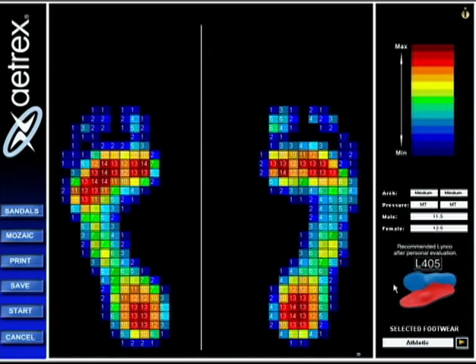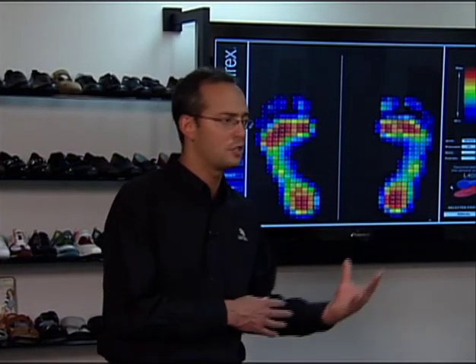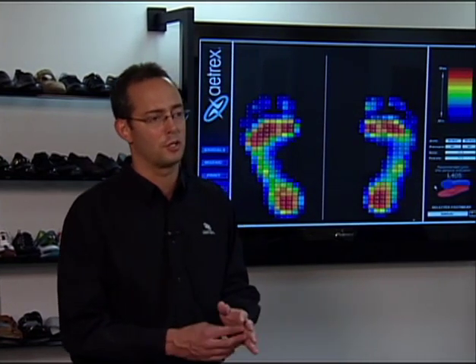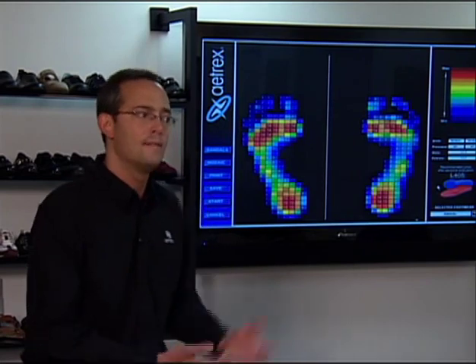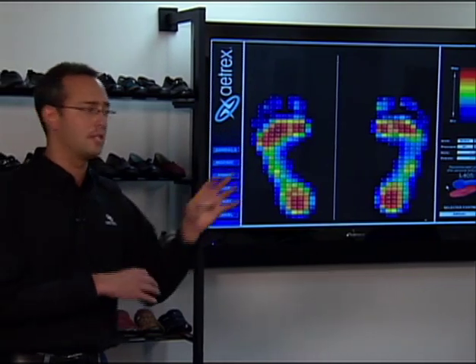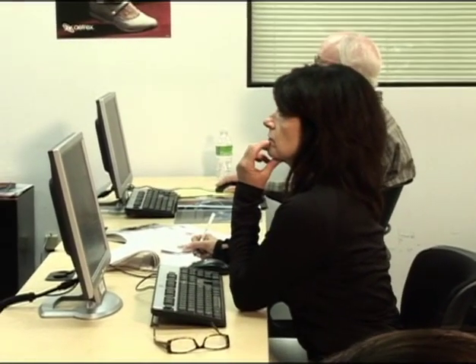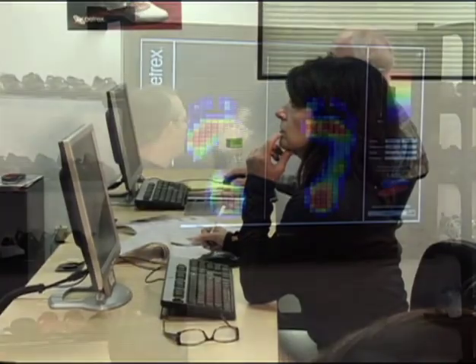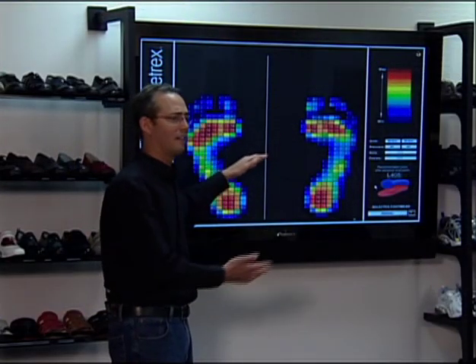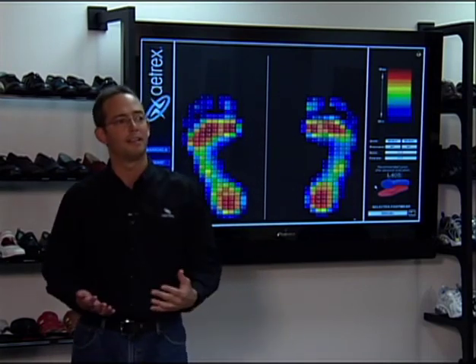If customers feel this is too conservative and you believe more moderate metatarsal pressure customers would benefit from a met pad, you can adjust it down to 13 or bring it from 14 and 3, or 13 and 4, and make a slight adjustment. I encourage you to experiment with it and see how it works. That's how the machine thinks — we get the settings all set up and it will count sensors. Typically at 13 or 14, if 3 or 4 are at that level, it will recommend a LYNCO with a met pad.